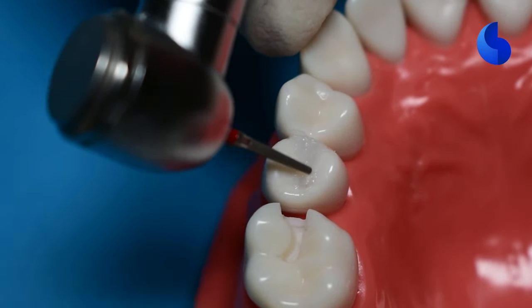You can also start defining your marginal ridge area. Like we saw, our marginal ridge is a little bit higher than our adjacent tooth, so you can start taking that down and you can start removing the excess flash that could have flown. Another great instrument to remove excess flash, especially in the interproximal area, is an interproximal carver, an IPC instrument. It looks exactly like a plastic instrument, except it has cutting edges and it's extremely thin and slender that you can take it to your interproximal area and take away the excess.